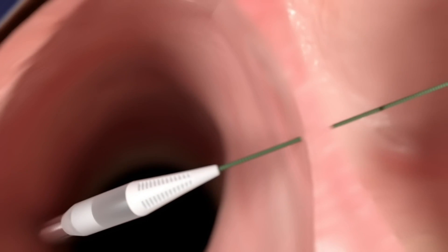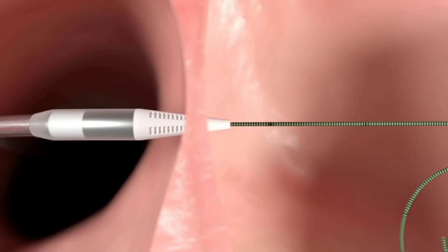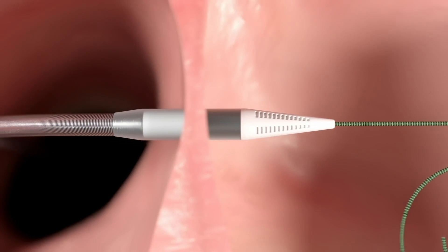The device is inserted into a blood vessel located in the groin and advanced over a guide wire into the heart by a physician. The device is advanced through a thinner portion of the heart wall called the interatrial septum.